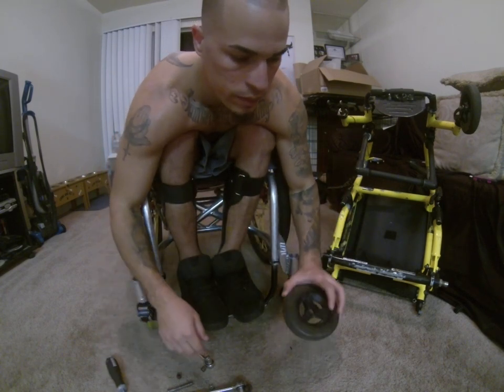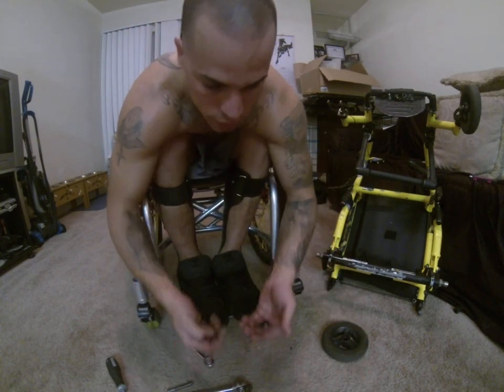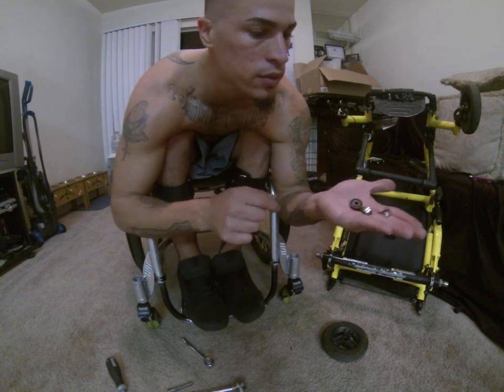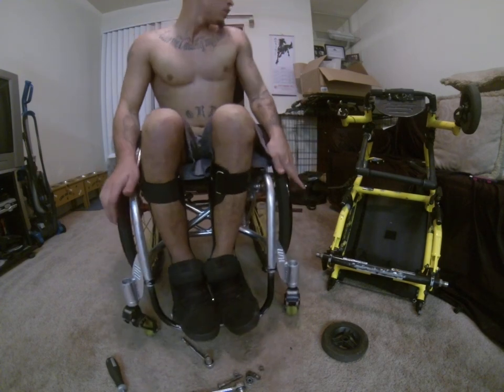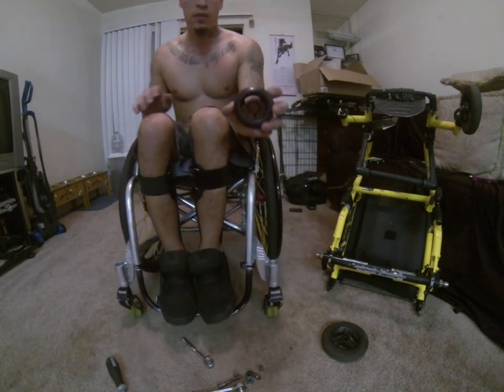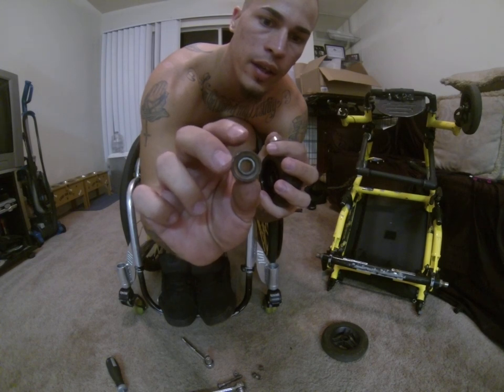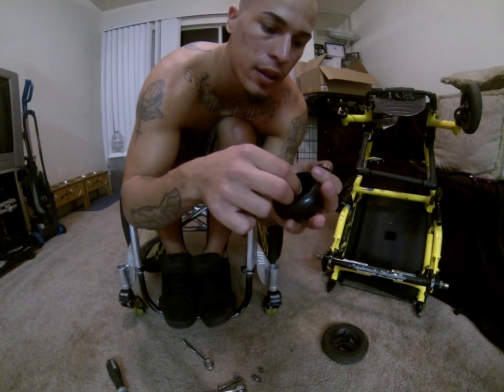There you go. So, now that you popped out everything, make sure you don't have a big mess, you don't lose your stuff. So you should have 2 bearings and 3 spacers or washers. Okay? Alright, so now let's put the new gear. Okay, you got a brand new one. You're going to pop your bearings in. See how it has 2 sides. One has like a red side or a cap on it, and then this side's kind of open. Put the bearing in with the open side inside.